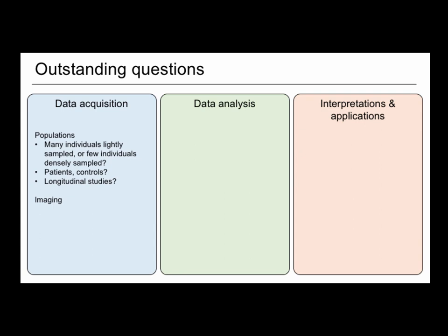Okay, and then we bring someone in and have them in the scanner. What do we acquire? I've already talked a little about scan condition, this idea of a stress test. I've focused here on function since my title had fMRI in it, but obviously there are also a lot of meaningful anatomical differences, and I think the ideal approach would be to combine these in some way: structure, anatomical connectivity with DTI, function, etc. And then behaviors. I've talked about how we get robust measures. A lot of these tend to be self-report, people filling out a psychological scale.